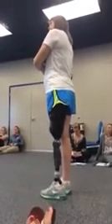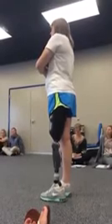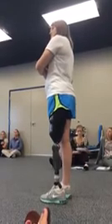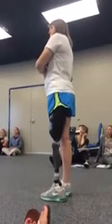So if you look at the medical literature, there's not one set step length that we all have. So like I said, we're talking about a minimum just to give us a good idea and make sure it's symmetrical from left side to right side. And then we're going to look at the toe load, knee flexion, pelvic rotation.